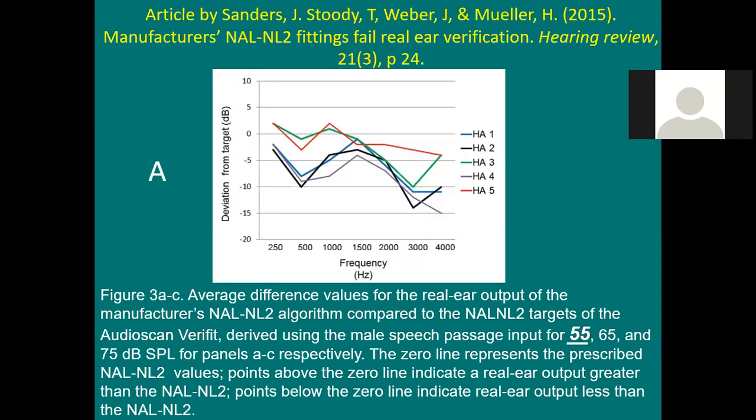So then you took off the hearing aid and put the Oticon hearing aid on. We'll call it the red. For example, I don't know which ones these are. They're all hidden. It's a blind study. They're not telling us who it is. But with the Oticon hearing aid programmed according to Oticon's NAL2, you'll find it's fairly similar to the Real Ear system's version of NAL2, but I'm shy of targets there too. Not quite as bad as with Starkey, but still shy in the highs.